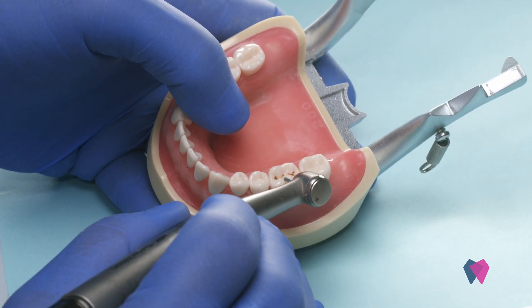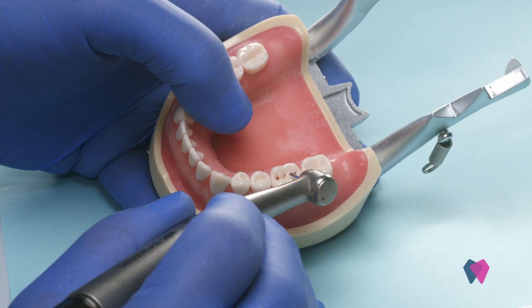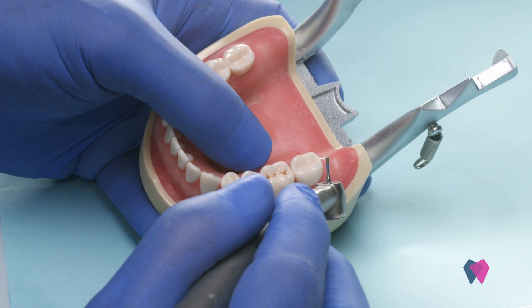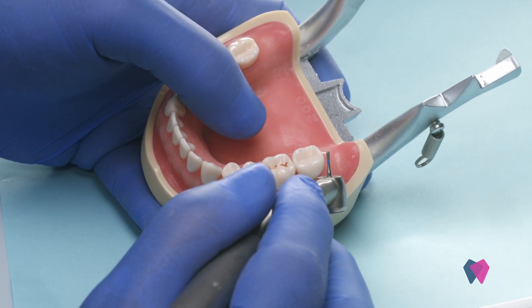When you take a look at tooth number 19 here, we're going to cut an occlusal preparation. I like to use a pear-shaped diamond when I have virgin enamel to work with or decayed enamel to work with.